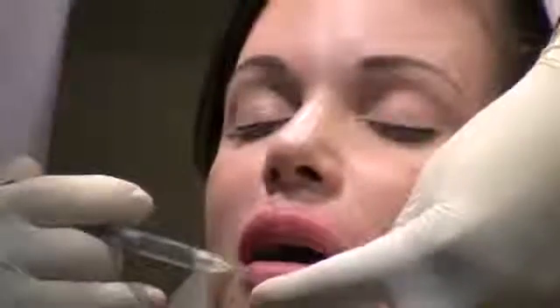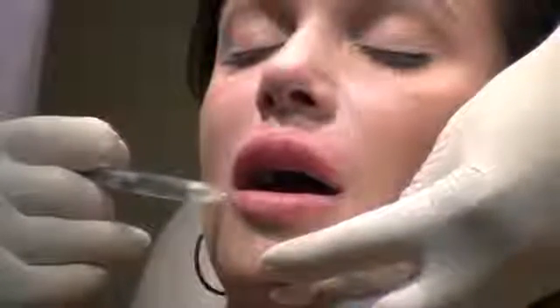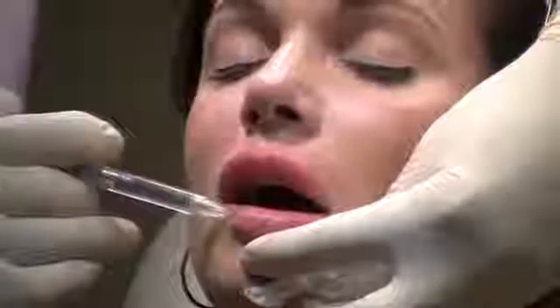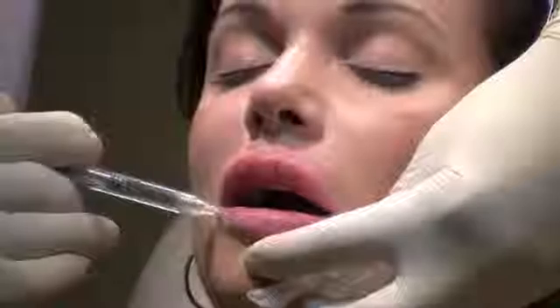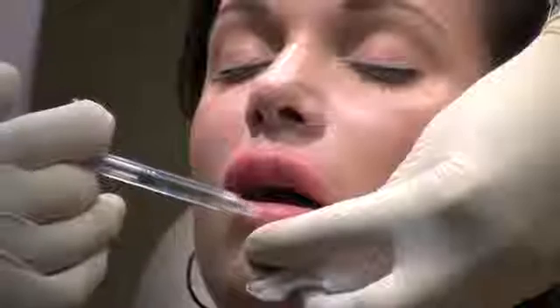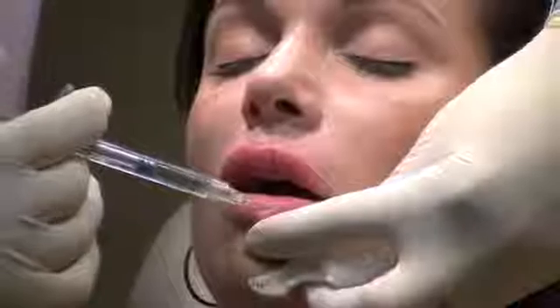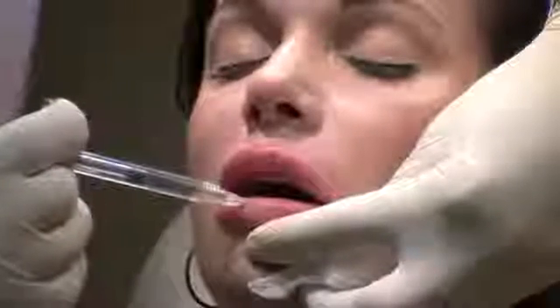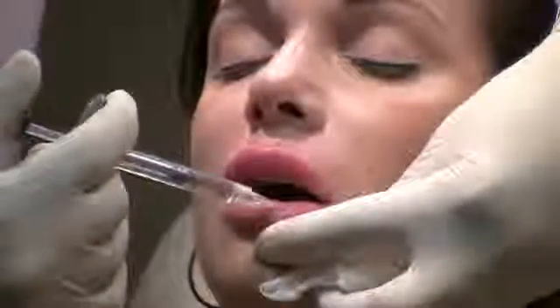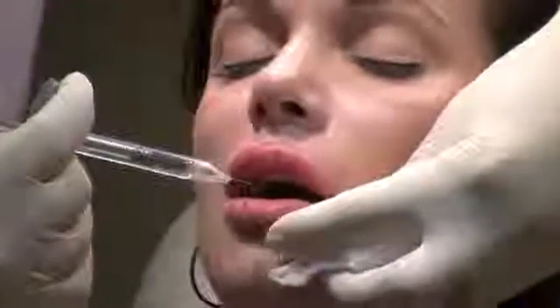We're going to go to the bottom lip. Same thing. Penetrating, filling as I penetrate, avoiding the labial artery, and also filling as I pull back. You can see with her so far, we haven't encountered any major vessels, so she hasn't had any major bleeding, which means she won't really have any major bruising so far.